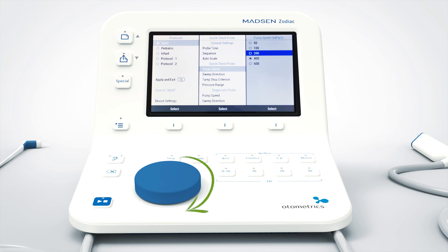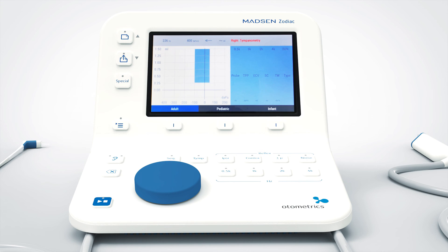In this example, 400 decapascal. To save my new settings I click the menu selection button again. I've now changed the pump speed in my adult protocol and I am ready to test my patient.